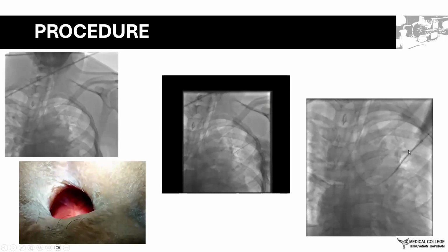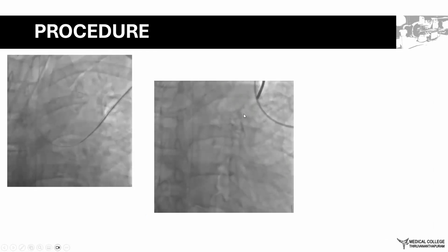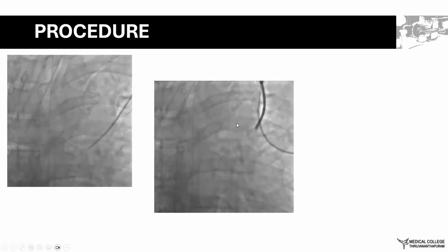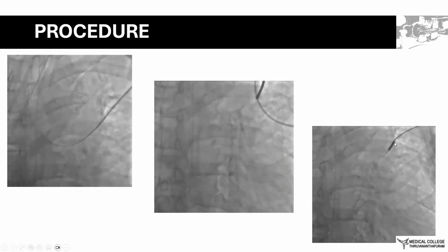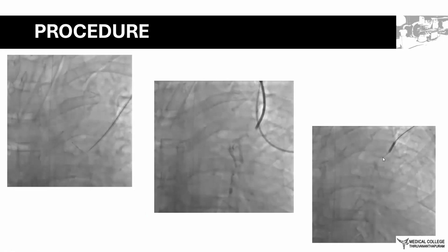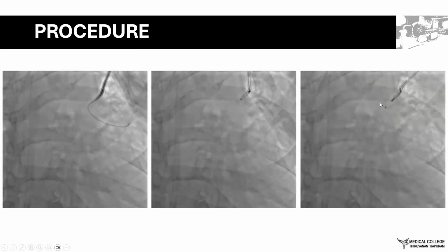Now, once the sheath was in situ, we have confirmed at what location we are in with instillation of around 1 ml of contrast agent. And then we have passed the plug through the sheath into the site of the left apico-posterior bronchiole. So this is the plug being pushed into the apico-posterior bronchiole. So this is the plug here.